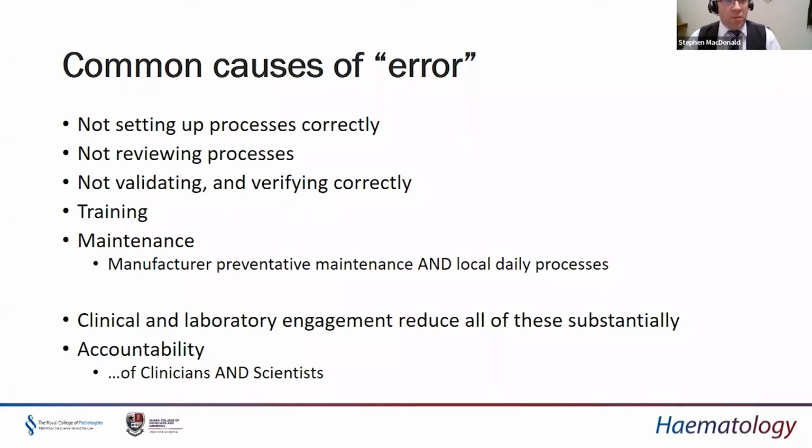So either not setting them up correctly or not reviewing them is a major source of error, because if you do that properly, you pick up the potential sources of error before they even happen, which is essential if you think about stopping errors propagating to patient results.